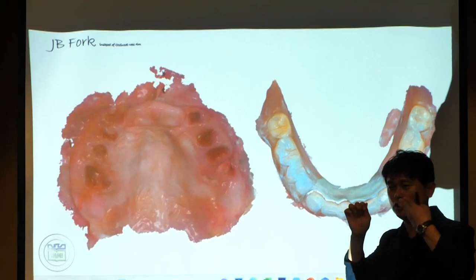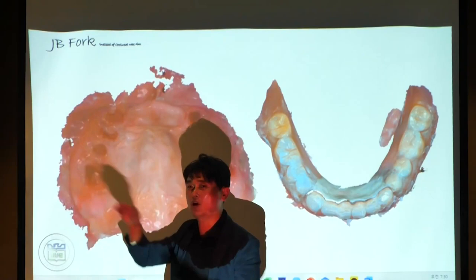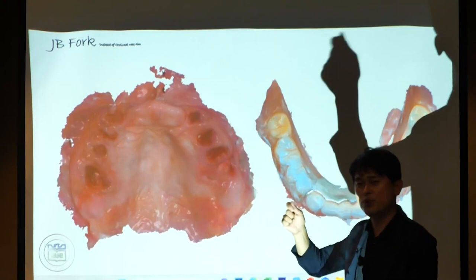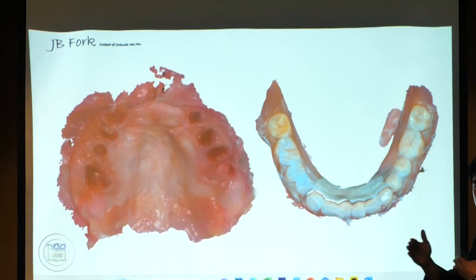If the assistant moves their hand, definitely you can scan a double layer or three layers. So it doesn't give you correct intraoral scan data. If you have any doubt, you had better take the impression with alginate first or silicone materials and then scan very simply with the intraoral scanner. If you have an intraoral scanner, your clinic will reduce many procedures, many steps.